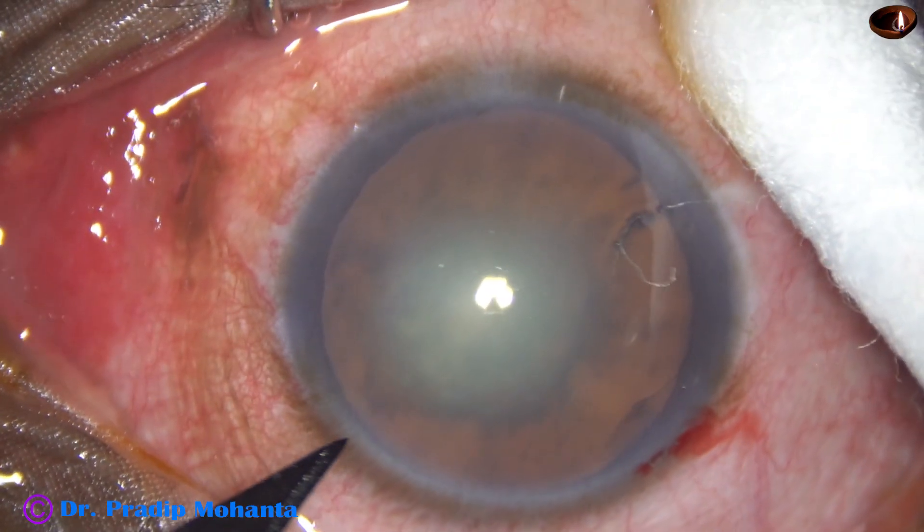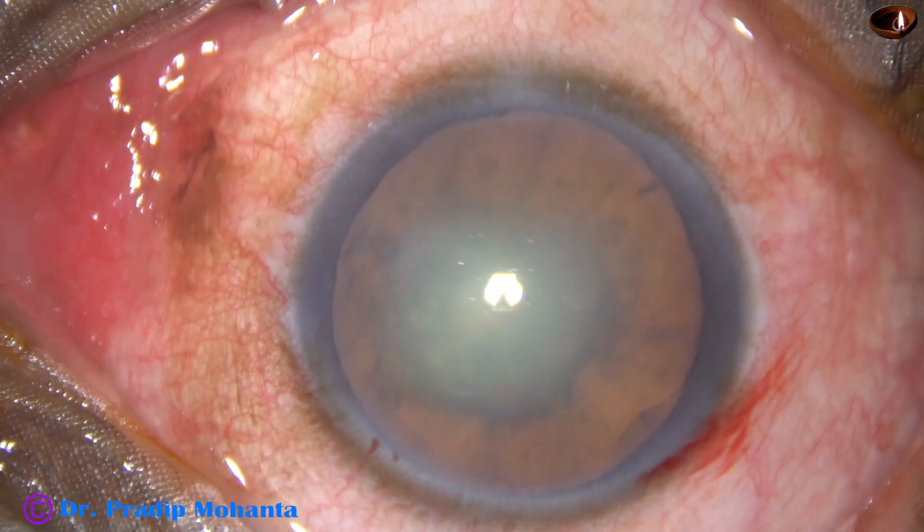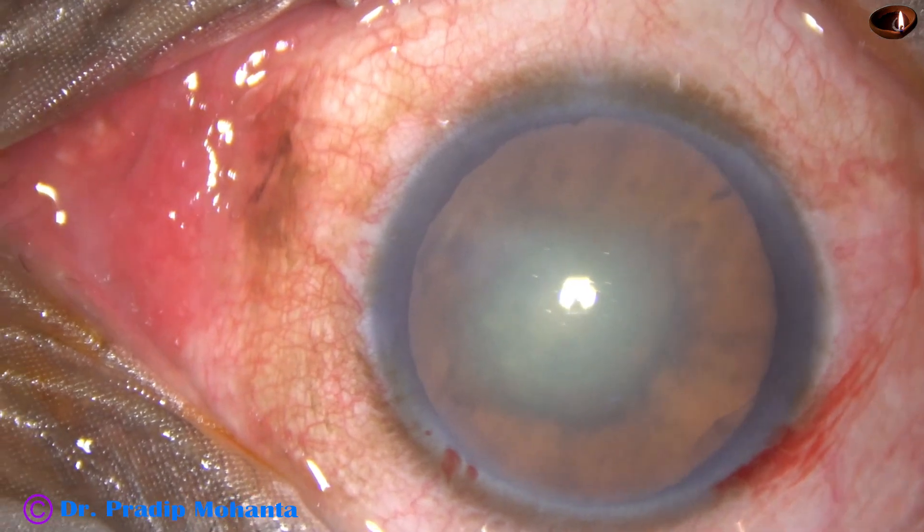The main incision has been made. This is a side port on the left side of the main incision, about two and a half clock hours away.